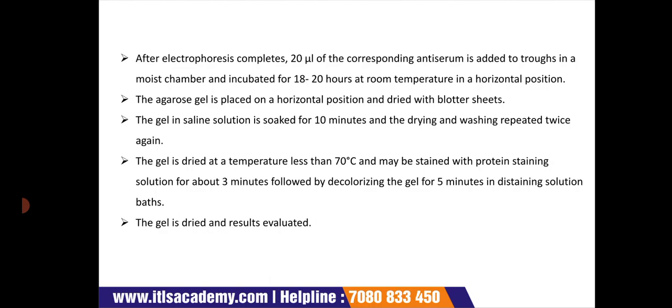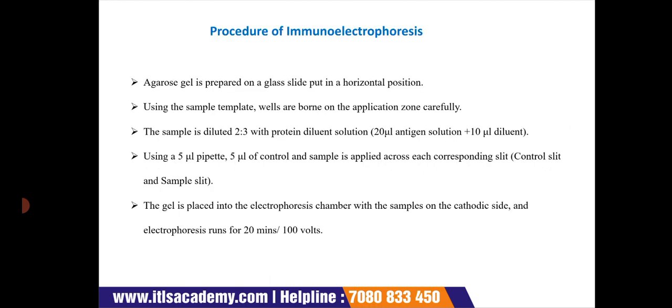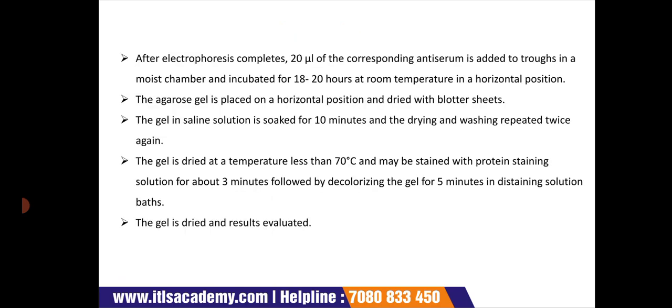Then you have to understand this and memorize this: how many minutes you have to stain this protein. Staining is for 3 minutes. Then you have to see what the incubation hours would be. So you have to keep the gel for 18 to 20 hours in the incubation. All these things you have to memorize and should know, as it would be helpful for the interview purpose.